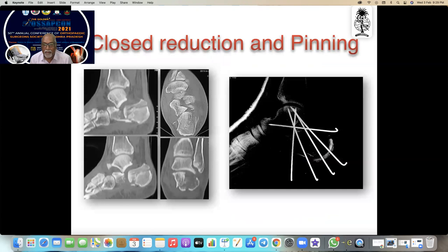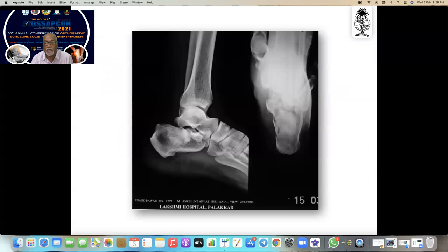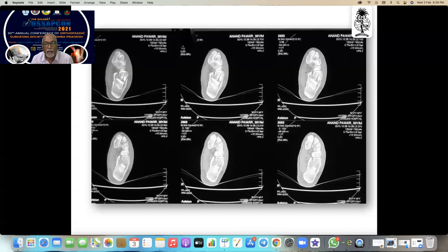My technique: I look at the CT scan, study the fragment very well, elevate it, and fix it in that position. This is a 30-year-old manual laborer who fell from a height. I take AP view, lateral view, axial view, and CT scan — I find out exactly where the fragment has depressed and where the fracture lines are.